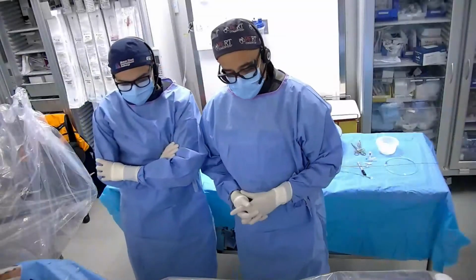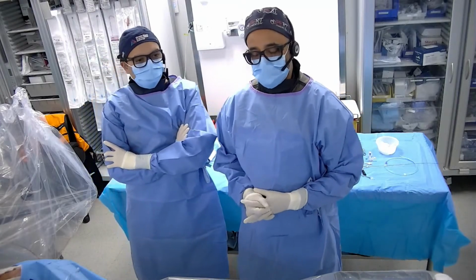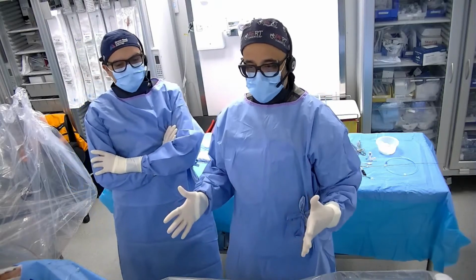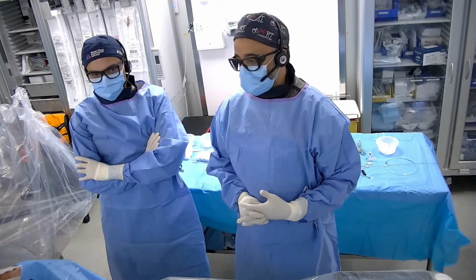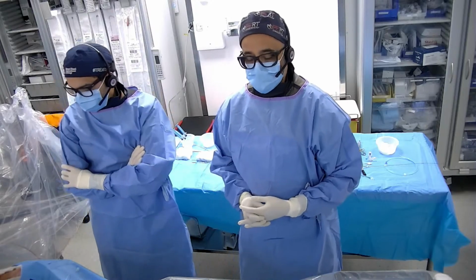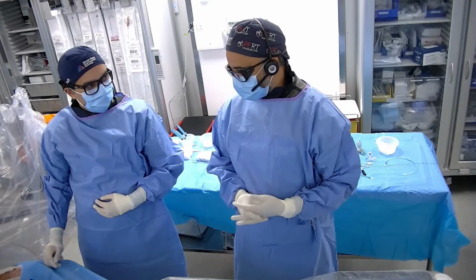Perfect. So Joji, you do a lot of EVAR. It was originally a Gore device. It's something that we see. I think EVARs, in essence, are kind of like a Band-Aid, right? They basically seal, but the process that leads to aneurysms is still going on in the vessel wall. So sometimes we'll see this degeneration of the neck or even the distal seal. You do a lot of these. Do you see this frequently?